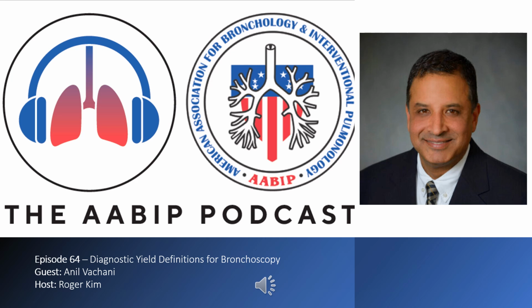I think we can all agree that a true positive is always the case whenever you have a malignant diagnosis, but pretty much any time you have a non-malignant diagnosis is where some of the gray zones and uncertainties start to creep in. Yeah, no doubt about it.